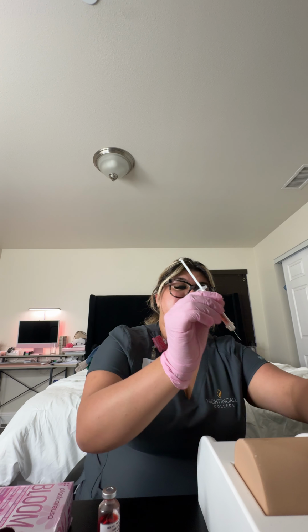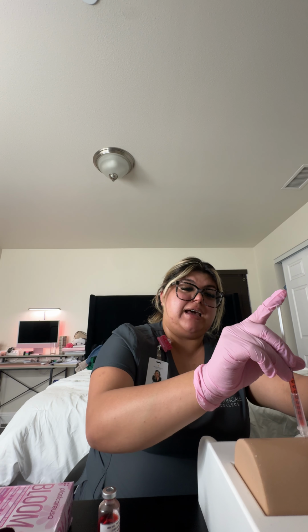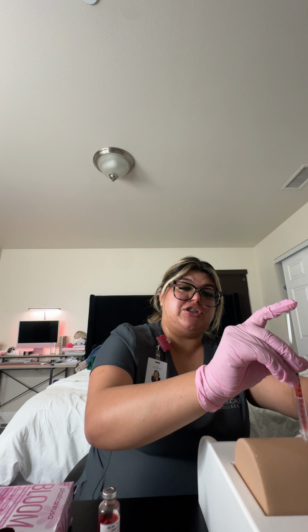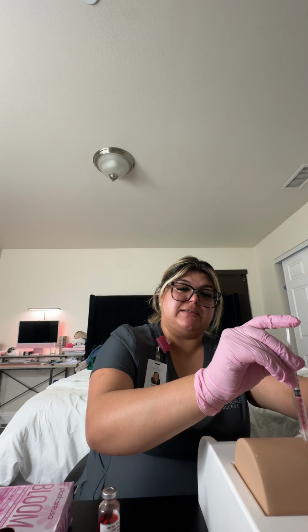We're going to grab another alcohol pad and we're going to clean the skin about 2 inches outward. Okay. And then we're going to remove the cap from the needle. We're going to pinch the skin, and at a 45 to 90 degree angle, we're going to inject. And because this is a heparin medication, we're going to keep pinching the skin, and we're going to inject the medication over 30 seconds.